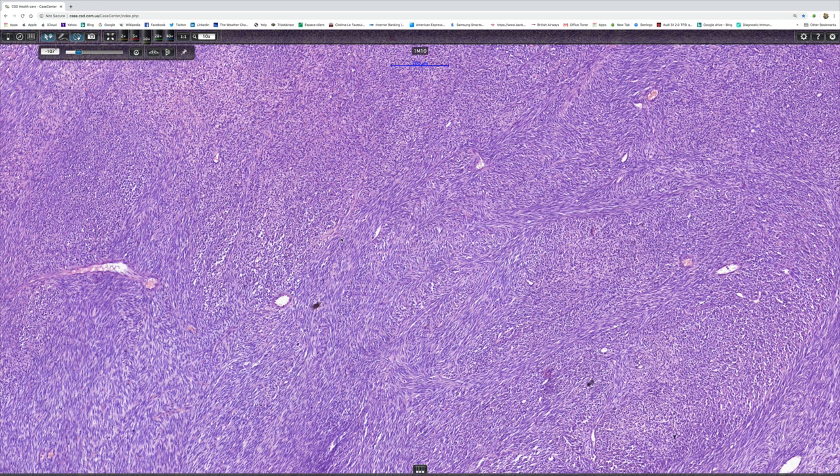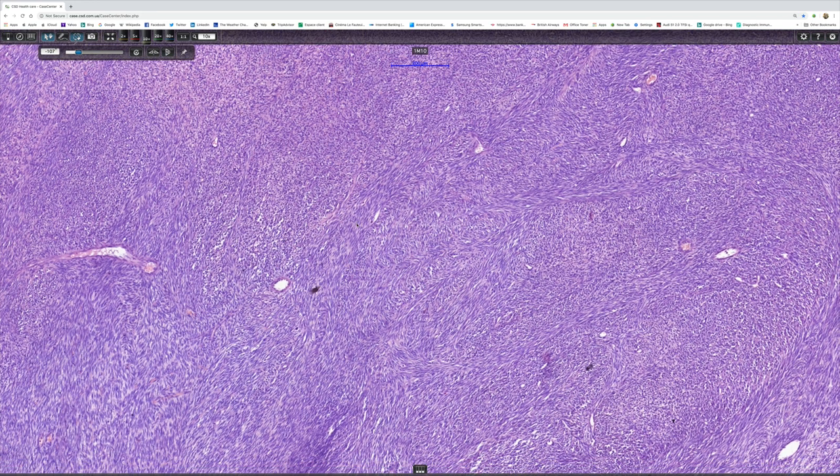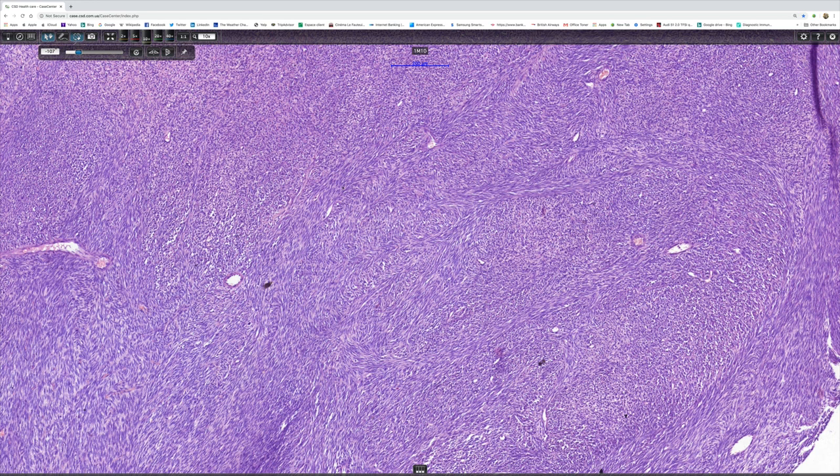I suppose it does relate to the bones of a herring in a way, but we use it more typically to describe a herringbone suit in which the woolen fibers are plaited together. These interlacing bundles, as you see here—there are spindle cells in that direction and that direction, and then at 90 degrees they come out of the screen at you.